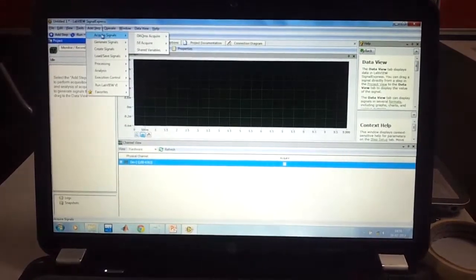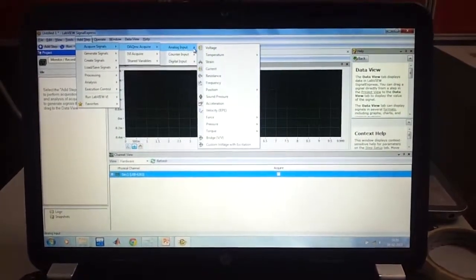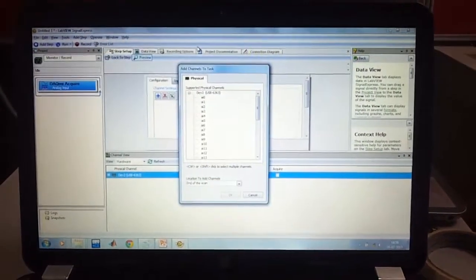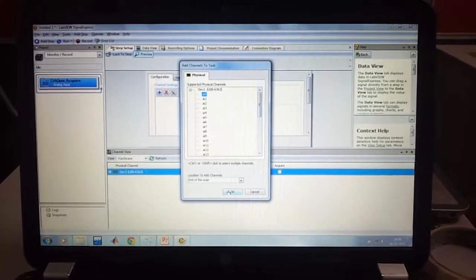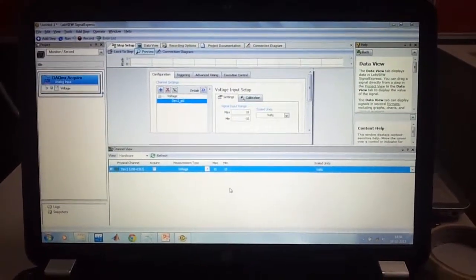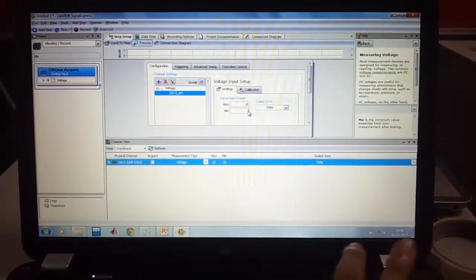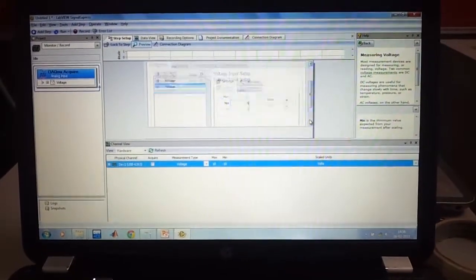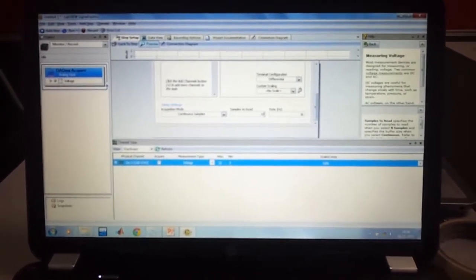I acquire the signals, that is the analog input voltage. Since I am using the AI0 channel, I select that. This is performed before the person views the PowerPoint presentation on screen. I am specifying the voltage range. I also specify the sampling frequency.